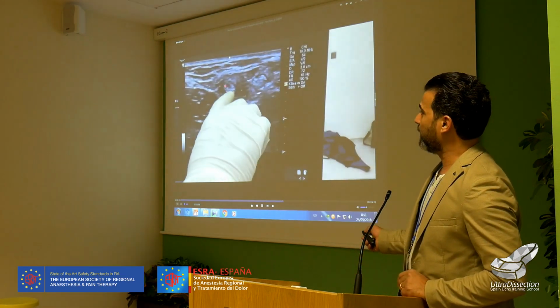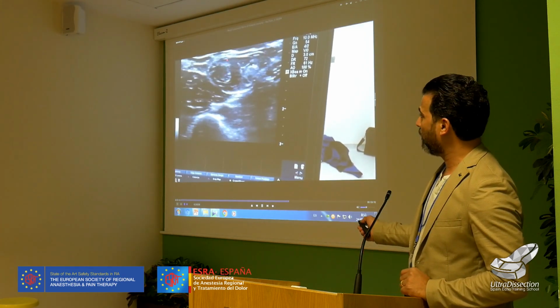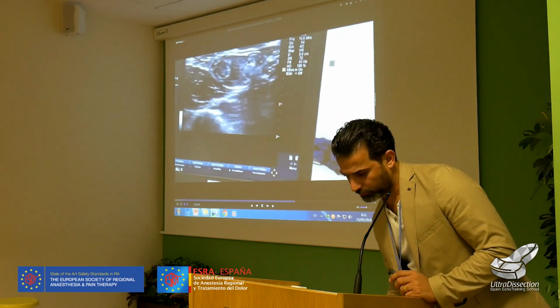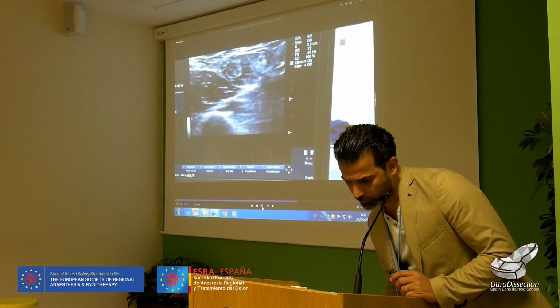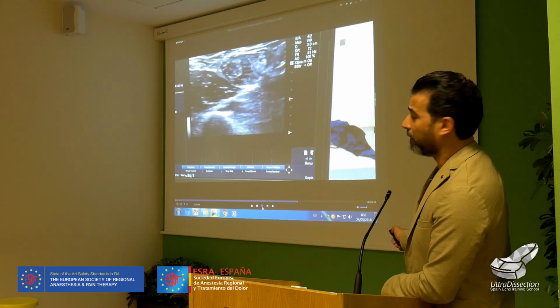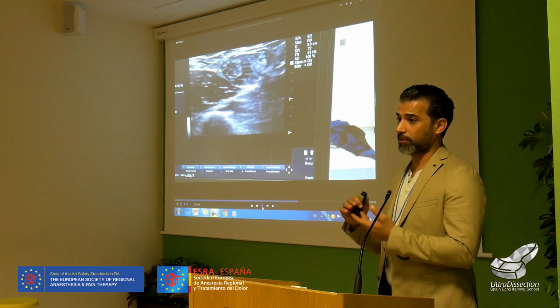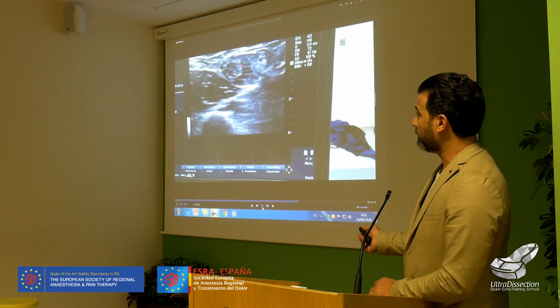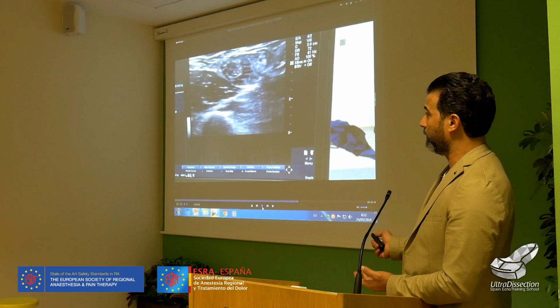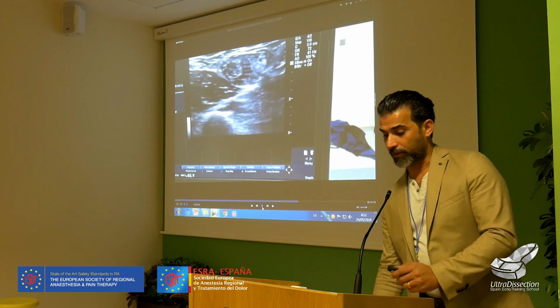So here the nerve. See now the nerve is different. This is the arising neuroma. So how do you see how many layers surround it? This is the nerve and this is the neuroma. See after the dissection, see how many layers, double layers surrounded the nerve. So this is the thickening from the fibrous tissue, scarring, granulation, the neuroma itself. So after the dissection, the nerve appears with 50-60% more echogenicity, and immediately the pain or the neuralgia subsided.